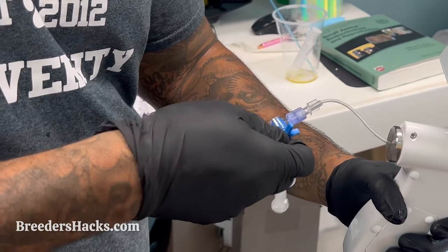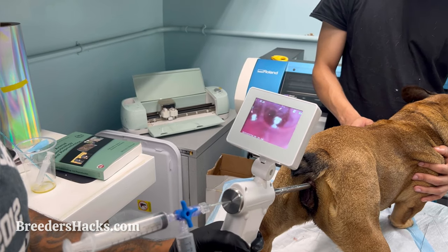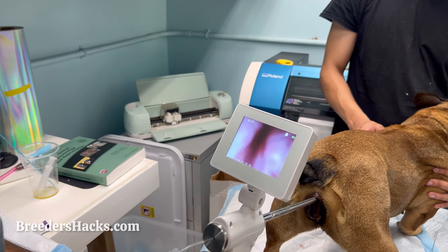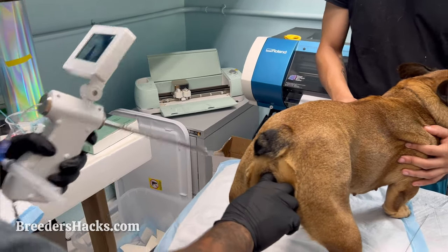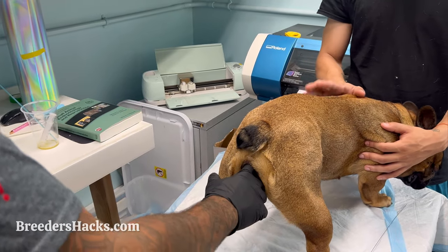Once we're in the uterus, turn the three-way AI valve to put the semen in — go ahead and load the semen in right there. Slowly pull back on the endoscope as well so you can see you're filling it up. Then turn around and, as we pull out, push some air through to completely clean out the line. Slowly pull out, and there we go. Put your finger to plug it in and that's pretty much it — we can stop recording and put the TCI gun down.